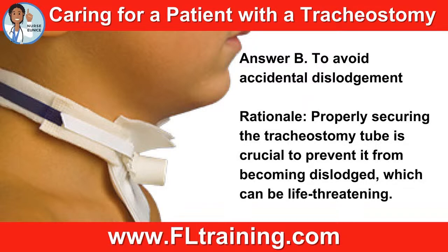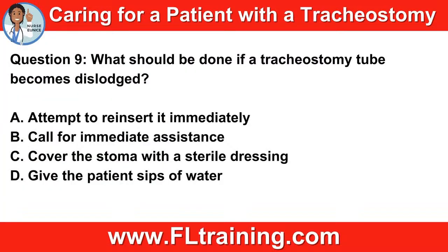Then look at that gauze, and then look at those ties, the ties that go around the neck, because if they're saturated, it takes 2 people to switch those out. You never want to be the person doing trach ties changes alone, because if the tube becomes dislodged, if the tube comes out, it's going to be hard for you to put it back in, and that's going to cause a medical emergency. So those ties prevent dislodgement or the tube from coming out of the trachea.